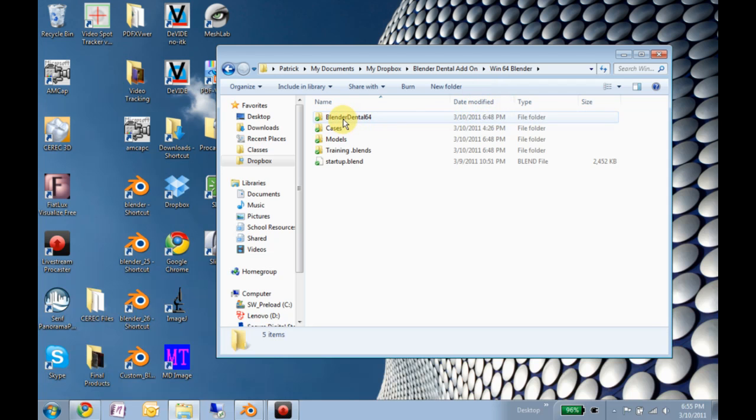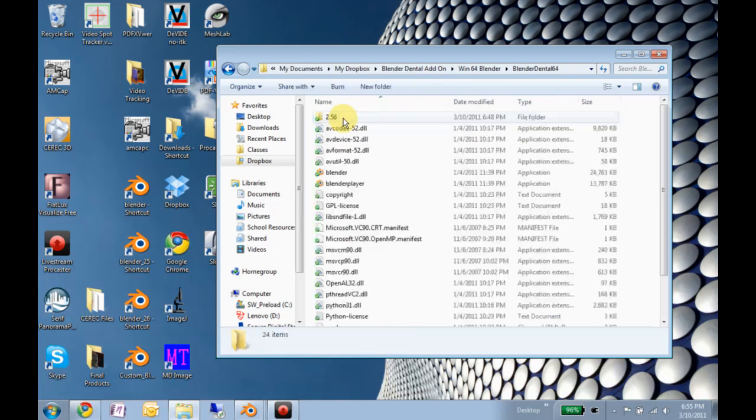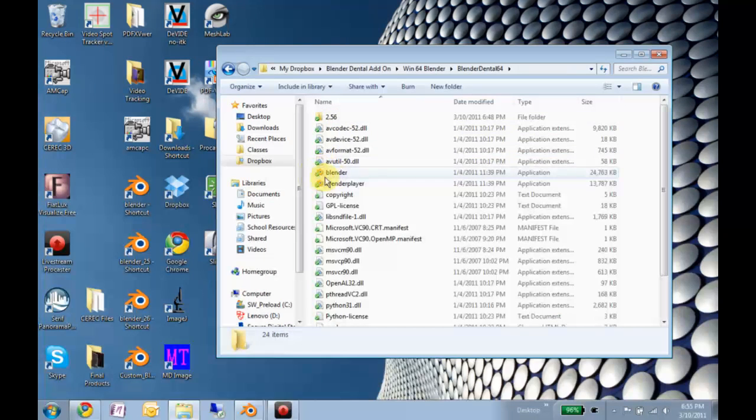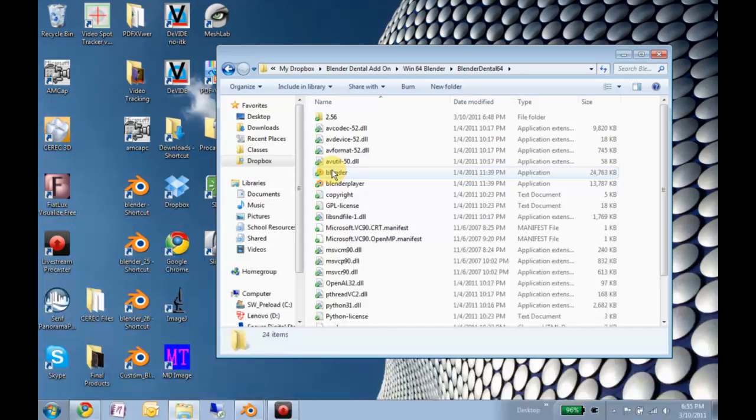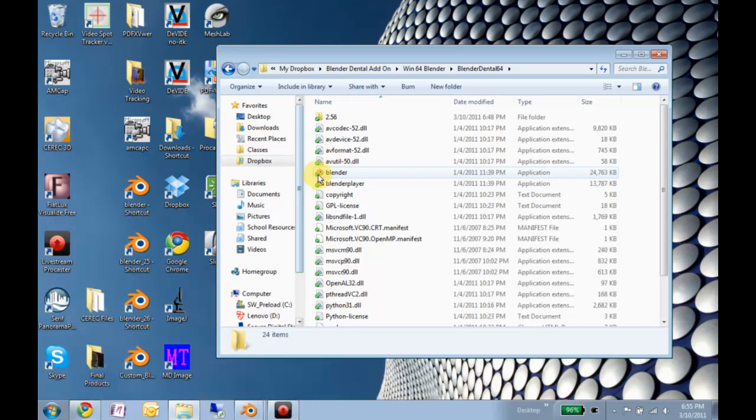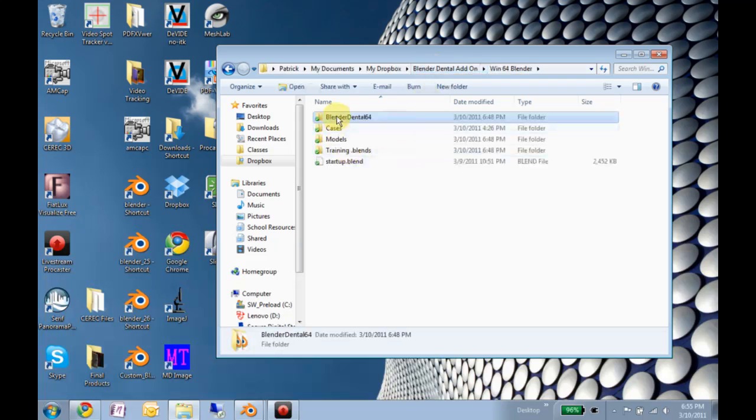In the Blender Dental 64 or 32, there'll be this Blender application. You can make a shortcut to that and put it on your desktop. Later you can just take this whole folder and copy it.